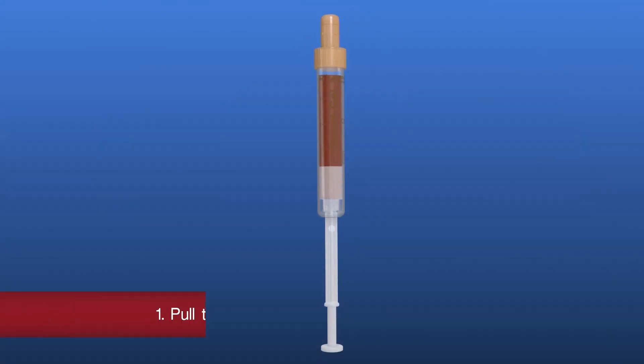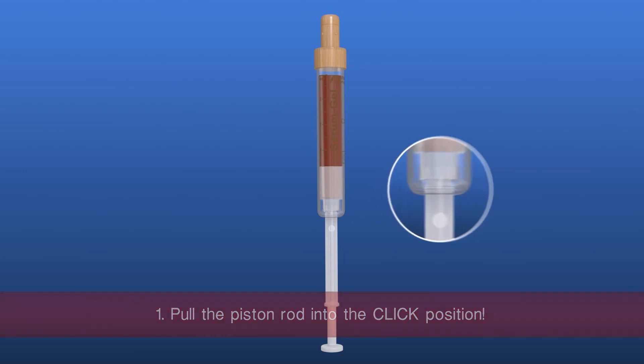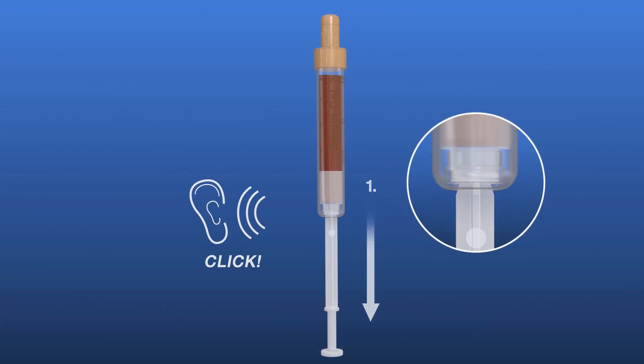Pull the S-Monovette plunger all the way to the end until it audibly clicks into place, then break it off.